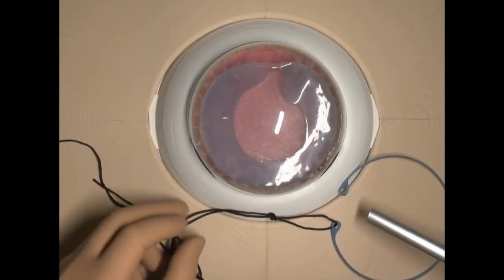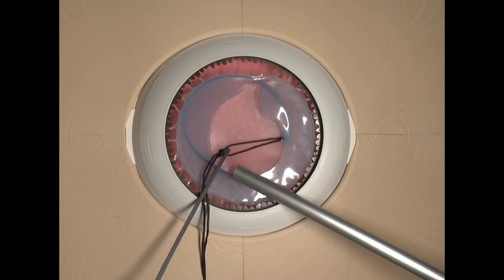We added a knot creating a loop to this technique and leading the loop by a Kuglan hook facilitates manipulation with the ring.